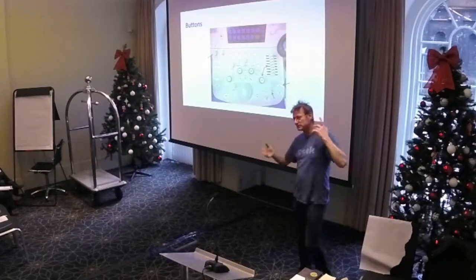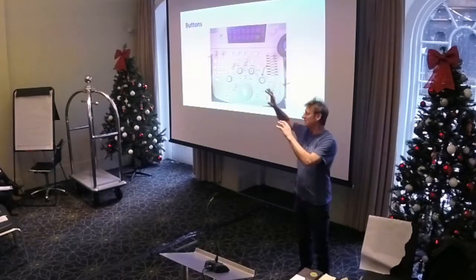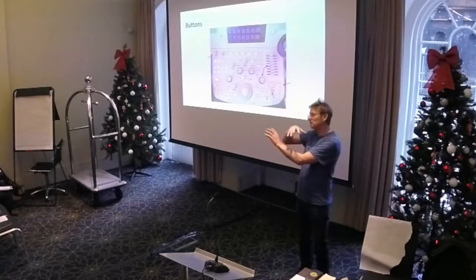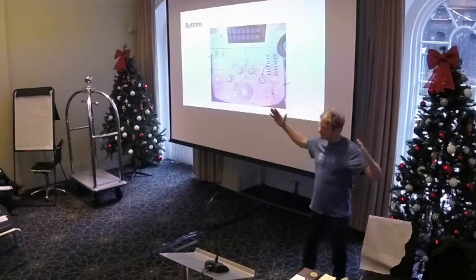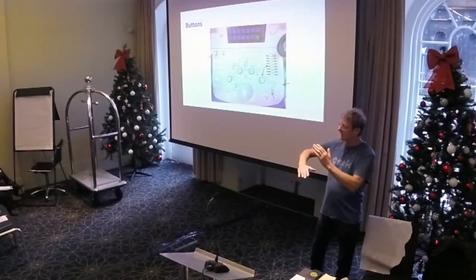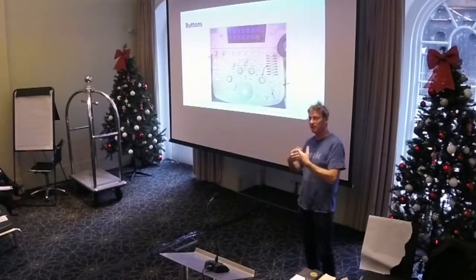There are different zoom options which I haven't got time to go into, but if you just zoom that in, it's still thinking about all the stuff you can't see and wasting computer power, so as a result you get a less good quality image. What you need to do is to bring in the width and reduce the depth, and then zoom, and then the computer's only actually thinking about the bit you're thinking about.